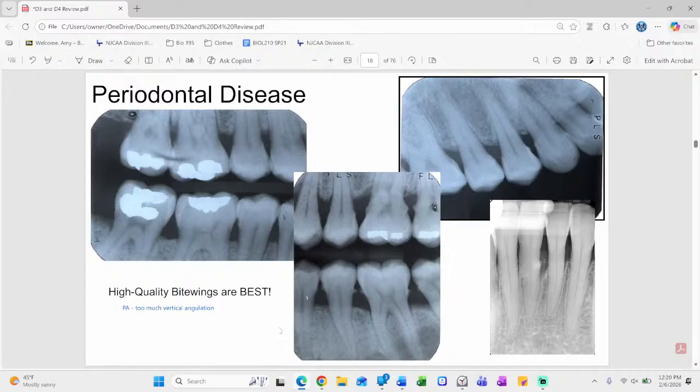You have a small mouth, a short front to back distance, so much easier for the patient to turn the sensor lengthwise so it's not bumping in and hurting, because they're not so compliant when that sensor's rubbing into the tissues. So turn your sensor, turn it vertical to create a periapical. You may not get as many teeth front to back, but you'll get a good image of what you're looking for. All right, never hurts to do that.